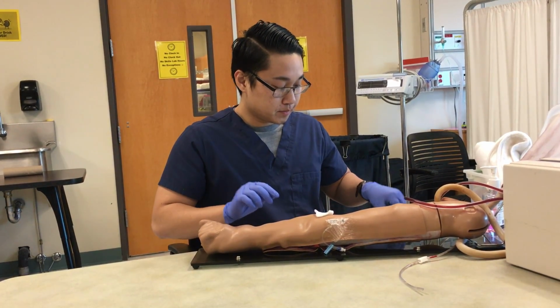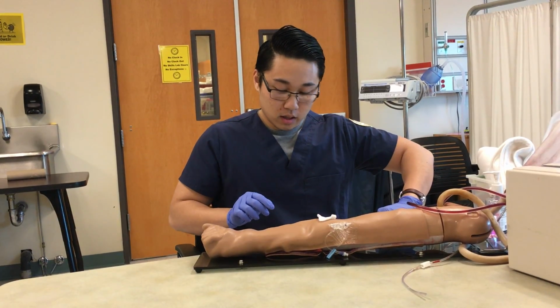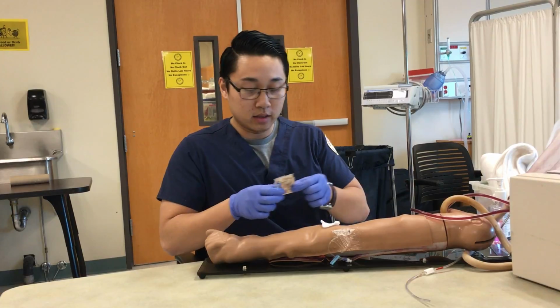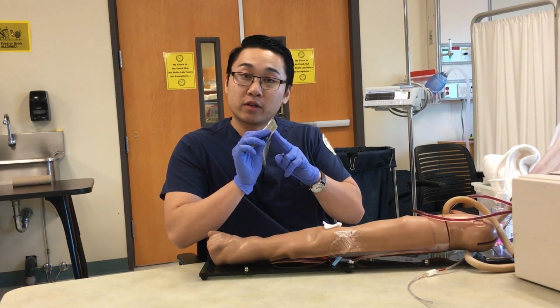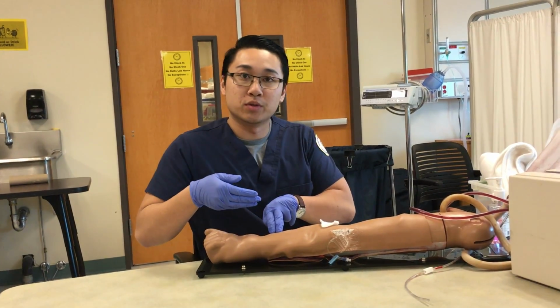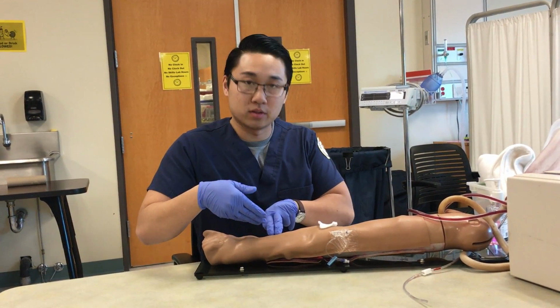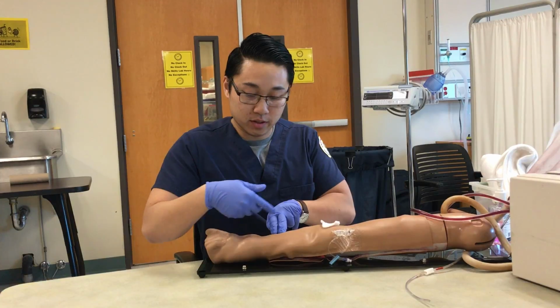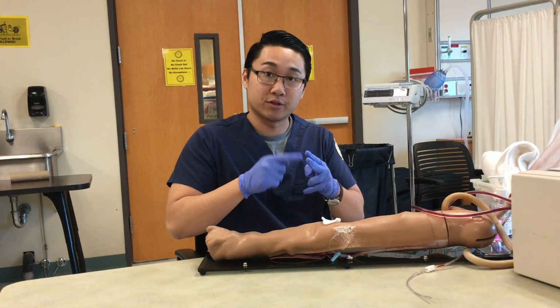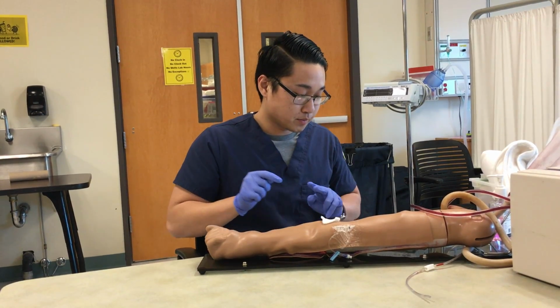Toss this away. And it's also a good idea to clean the tip of your finger gloves, because when you're palpating, you don't want to introduce any pathogens or any microbacteria to the site to cause a skin infection. So it's always a good idea to sanitize yourself before you do anything.